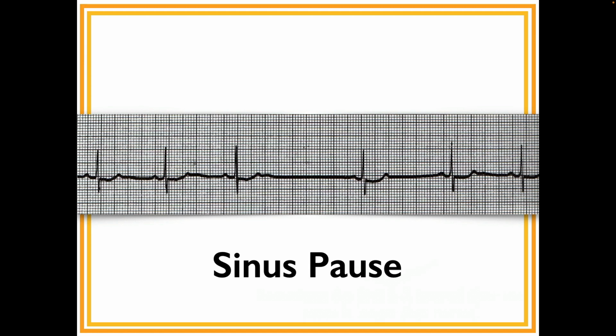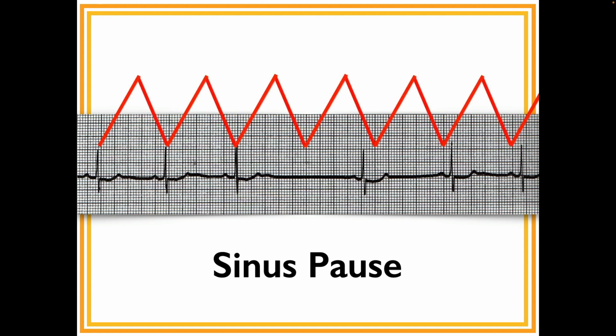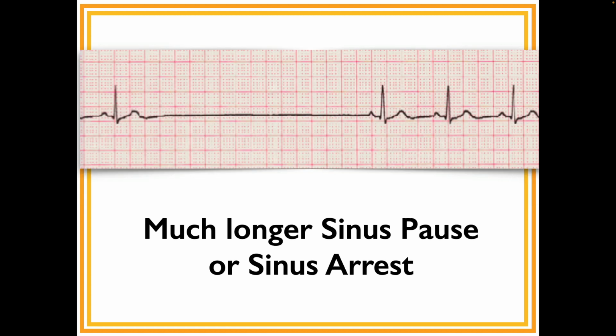But again, here's a sinus pause, and you can see it doesn't come in quite on time. It also comes in pretty slow. You can see there's a pretty big gap, and then it starts up again. Now, something like this, I don't think you would feel. Here's a much longer one, and I probably would call this a sinus arrest, because it's almost 3 seconds.